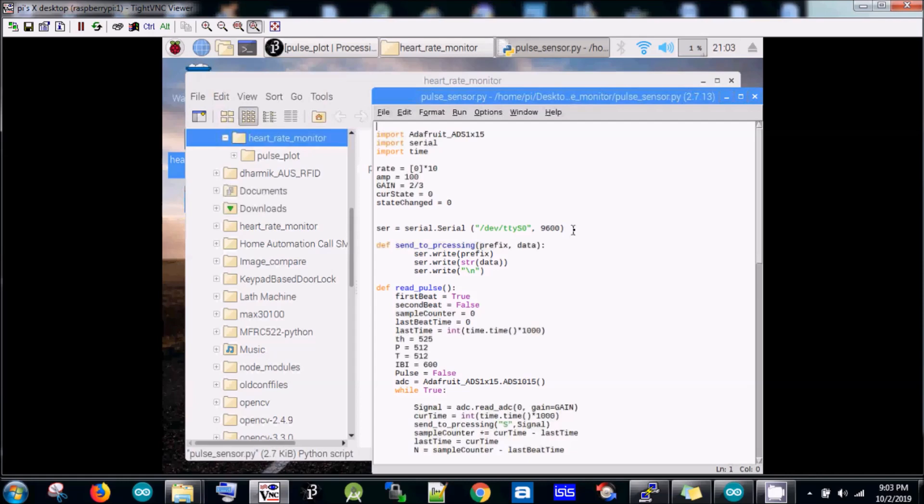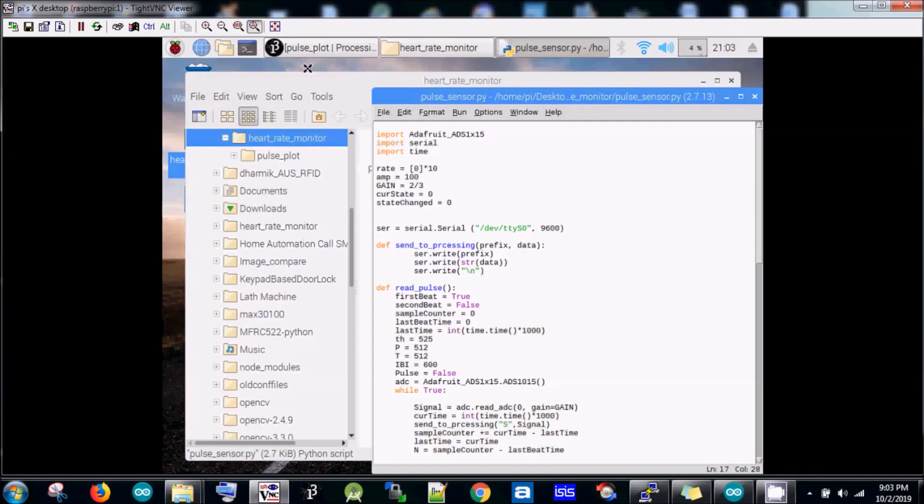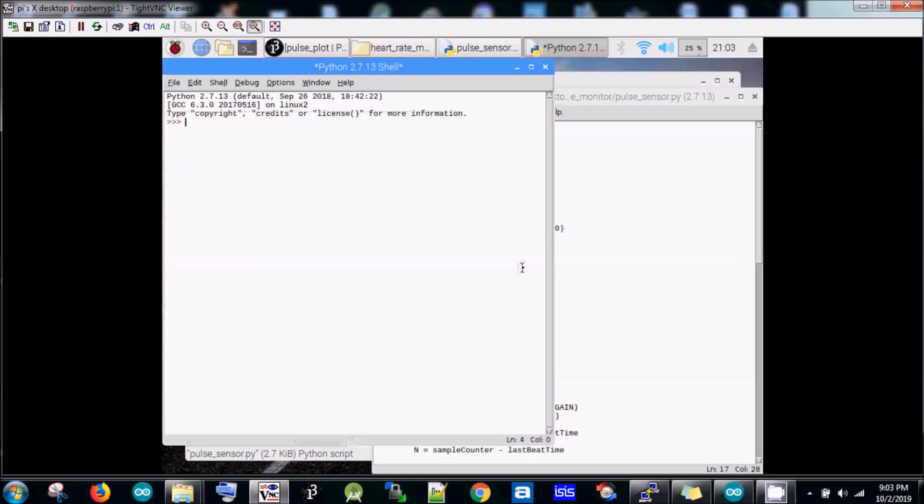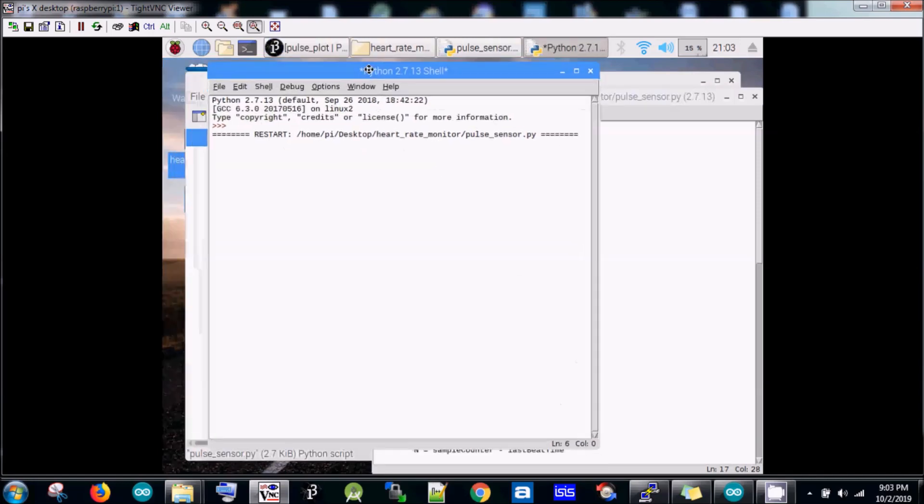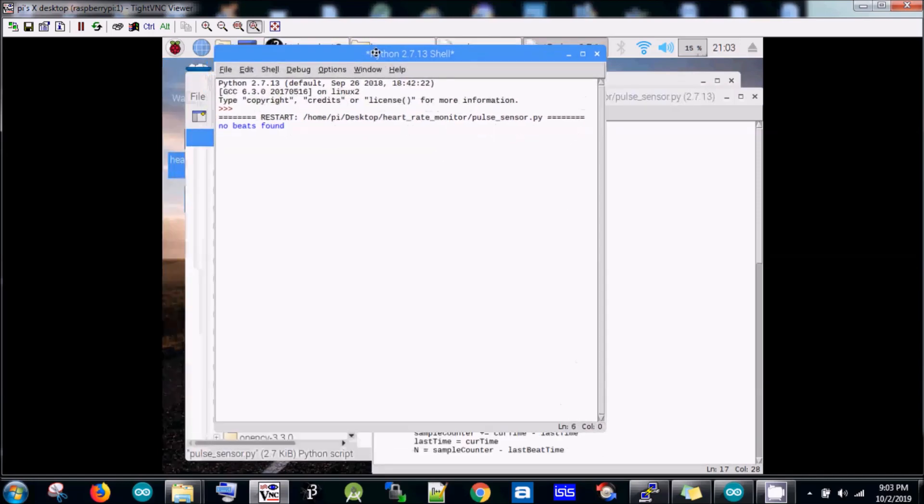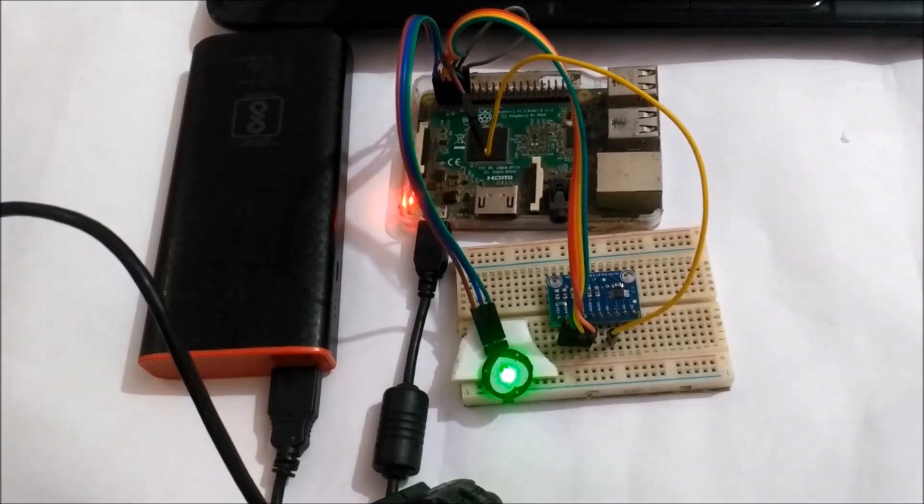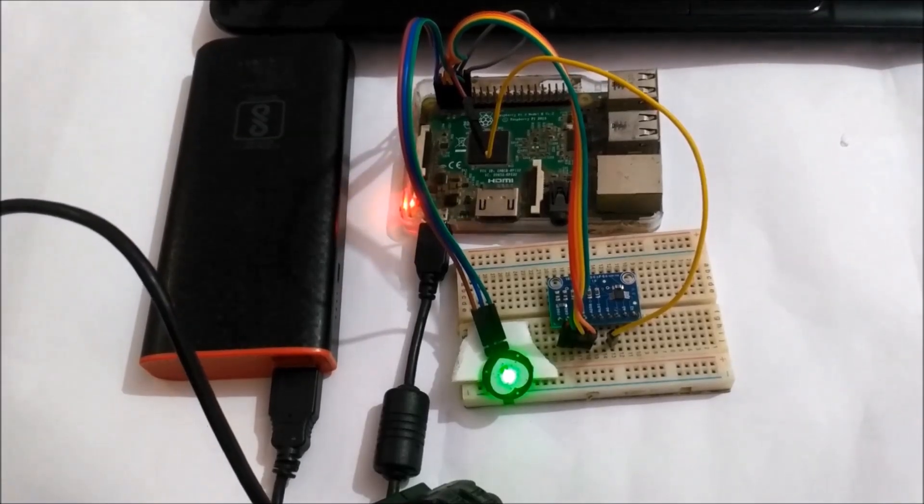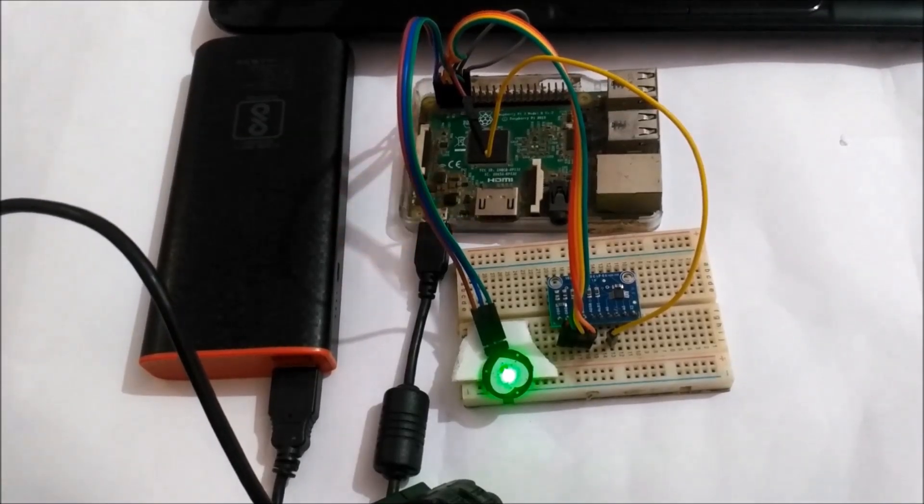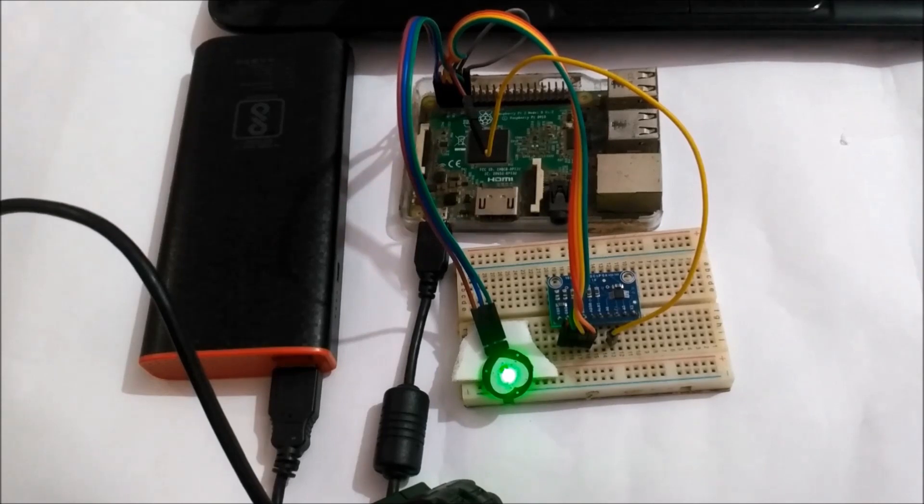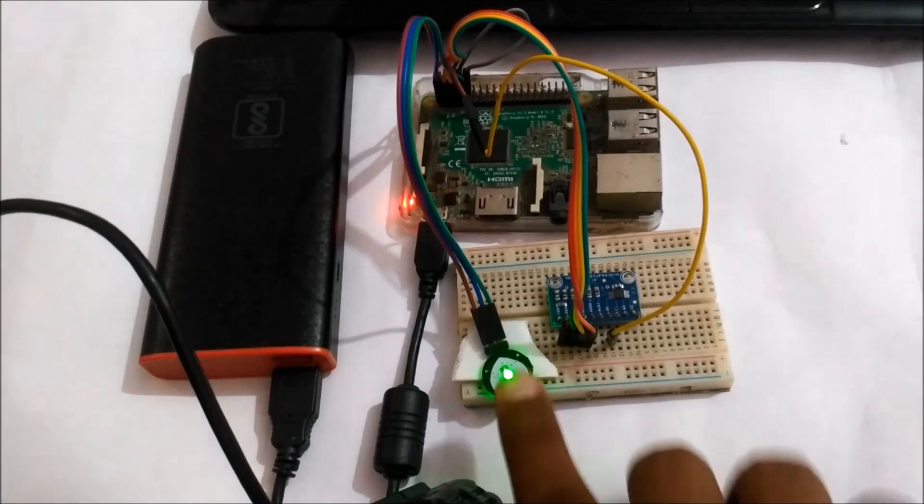Here we can see we have used this ttyS0 port. Now I'm going to run this. We can see there is no beat found, and if a beat is found it shows some garbage data. Now I'm going to put my finger over the pulse sensor.